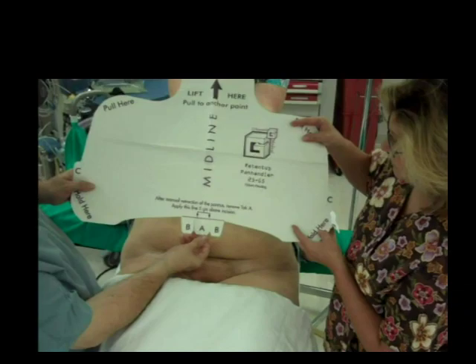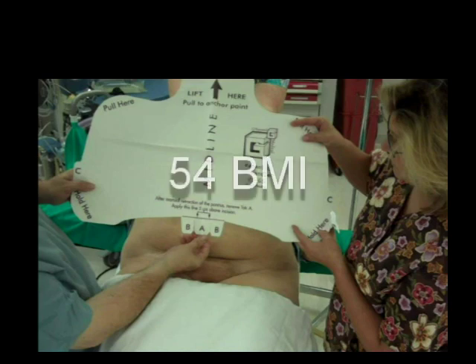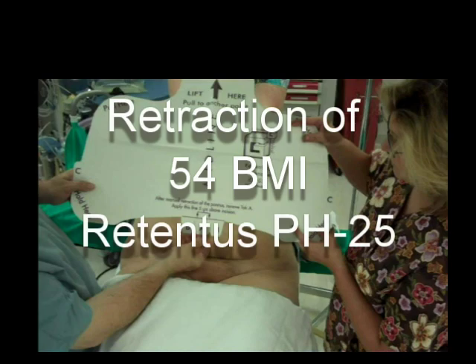On the next slide, you will observe the scrub tech with the surgeon, who are being assisted by the anesthesiologist or a third person at the patient's head. Three people are usually required to apply the device correctly. The third person at the head of the patient will manually retract the pannus.